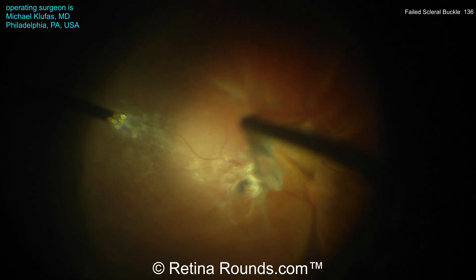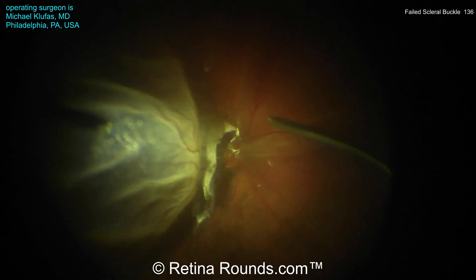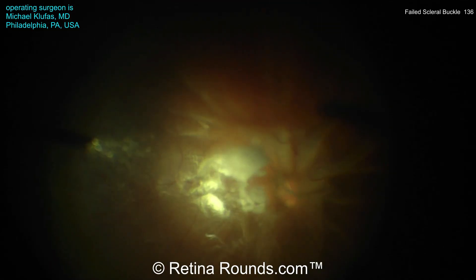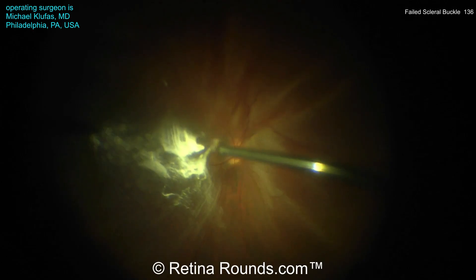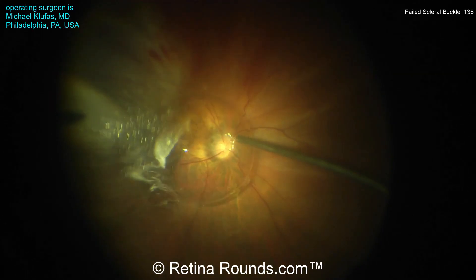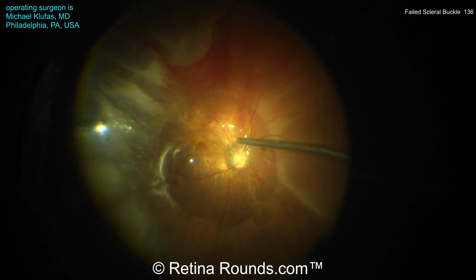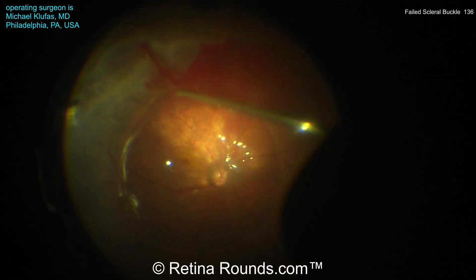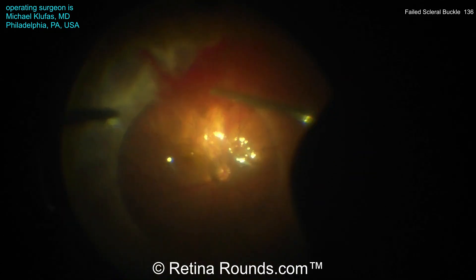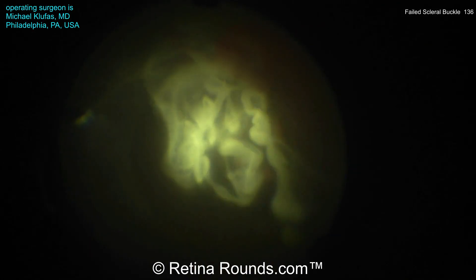In patients with a failed scleral buckle, sometimes there can be significant residual vitreous traction. And in these eyes, elevating the PVD can be particularly challenging. Dr. Klufus has stained and is now engaging the hyaloid face. You can see that the PVD has been elevated at least over the posterior pole over the macula. And now Dr. Klufus is going to put some perfluorocarbon liquid down to provide a little bit of countertraction. In this retina that's completely detached, pulling up on the hyaloid can be particularly challenging since there's no countertraction.